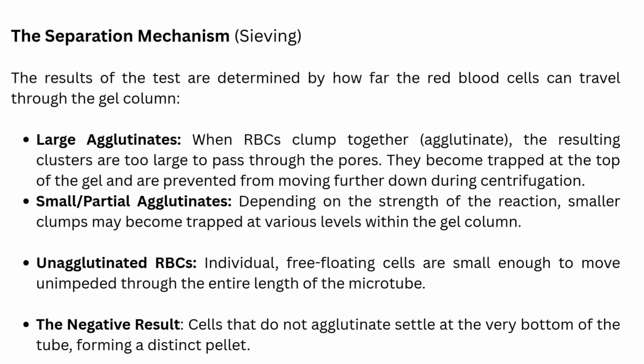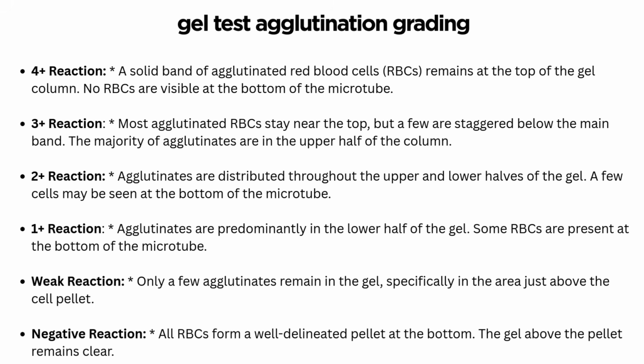And this separation mechanism is important because it visually illustrates the test results, allowing for straightforward interpretation of whether or not agglutination has happened. And as we move to the next slide, we'll explore the grading of these reactions and their clinical implications in more detail. So this one is based on the book of Harmening. So the source is Harmening for this one.